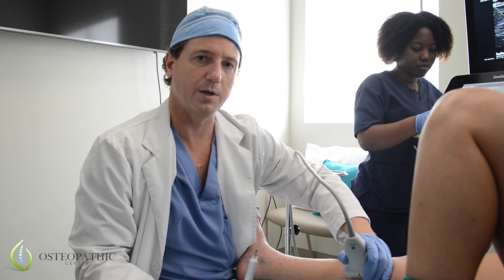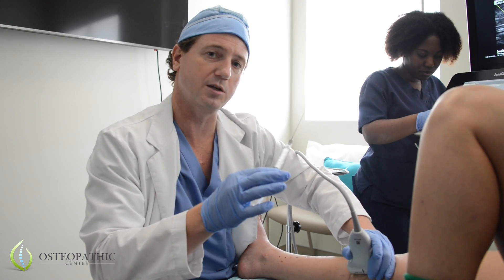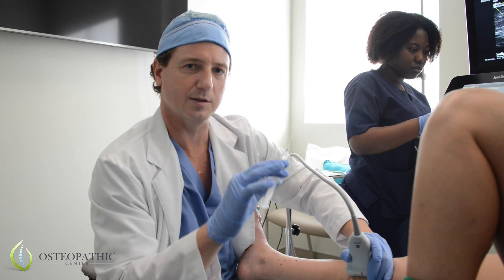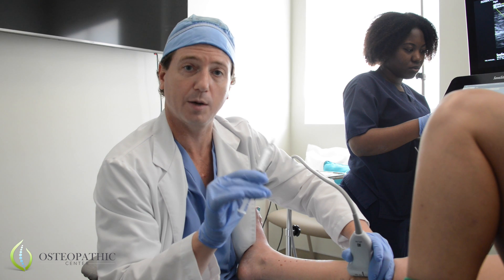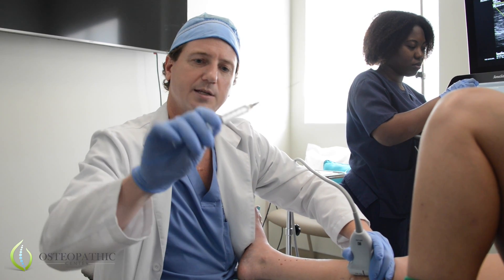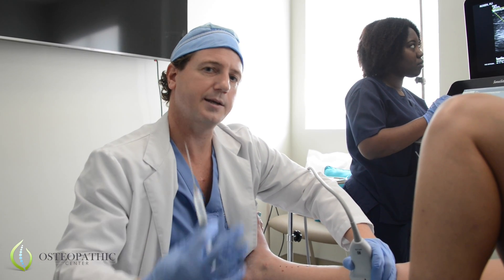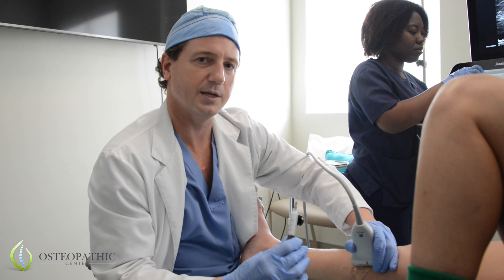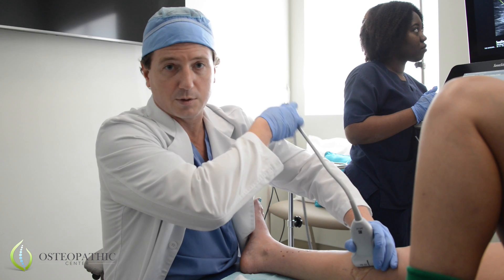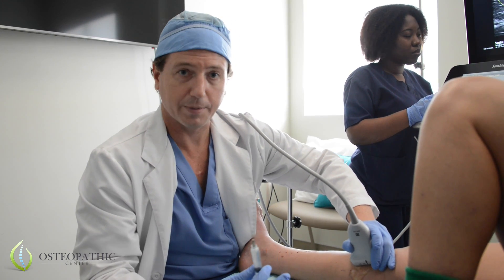We've already numbed the areas and know where the injuries are. The type of regenerative injection we're doing today is amniotic tissue allograft by technical definition. This was cryopreserved at negative 80 degrees, we unthawed it, and there are very fine pieces of tissue in here, which allows the body to grow new tissue on top of it. I see much better results with this product compared to everything else I've used — bone marrow, adipose, fluids, PRP, and prolotherapy.